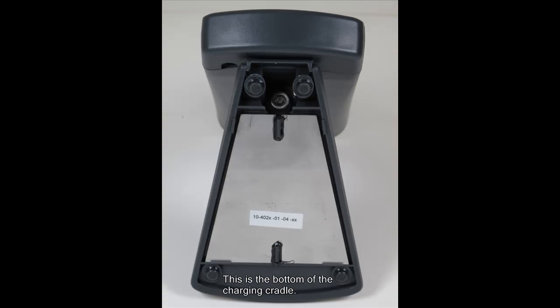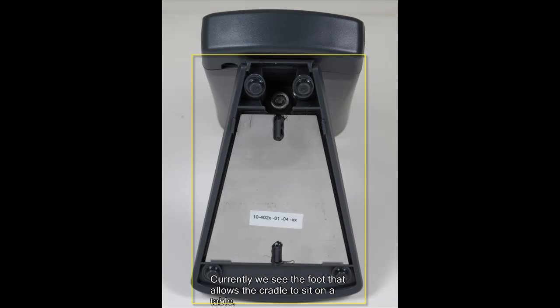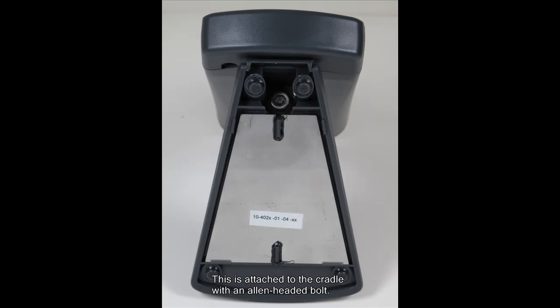This is the bottom of the charging cradle. Currently we see the foot that allows the cradle to sit on a table. This is attached to the cradle with an Allen-headed bolt. When you need to mount the cradle onto a bed or wheelchair you must remove this foot. More on mounting options for the Sicare in another video series.